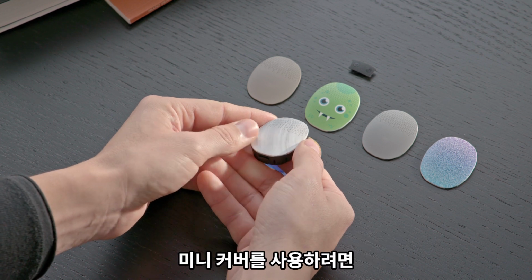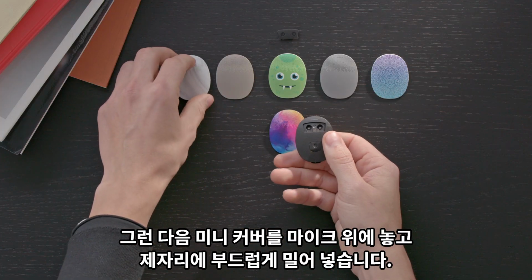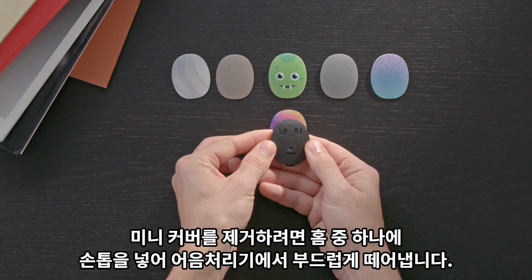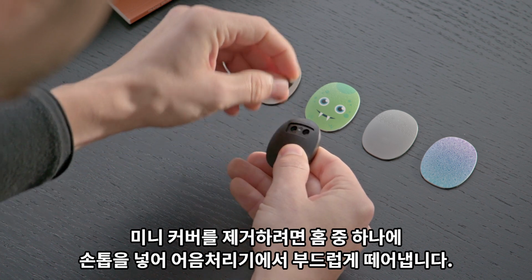To attach the mini cover, first remove the existing cover, then position the mini cover over the microphone slots, and gently push the cover into place. To remove the mini cover, insert a fingernail into one of the grooves, and gently peel it away from the audio processor.